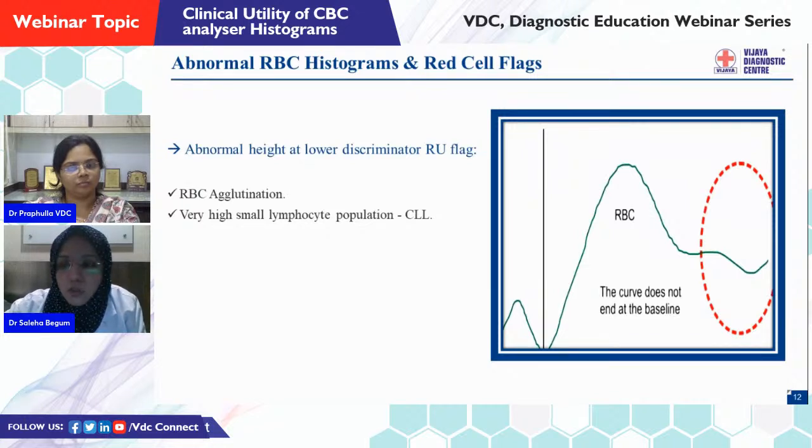Here, the graph is not ending at the baseline. Instead, it is abruptly ending somewhere in the middle. This means that there is some population of cells which is having a size larger than an RBC, and the upper discriminator is unable to decide on the placement, and hence the graph ends abruptly. So the reason for such a graph will be RBC agglutination, where many RBCs are clumped together, and they become larger size particles, and that's how they are represented at the upper end of the graph.